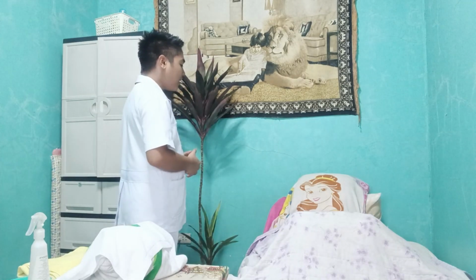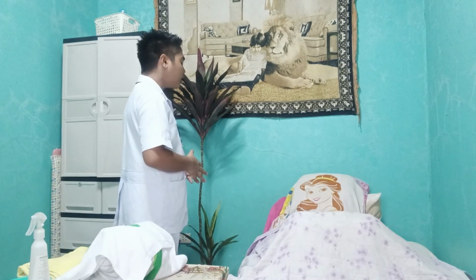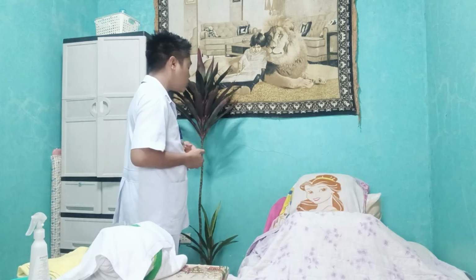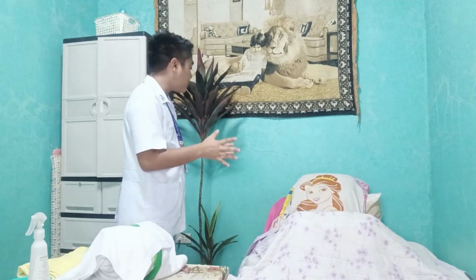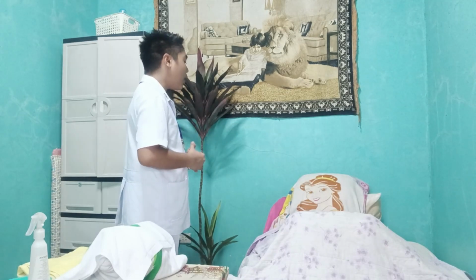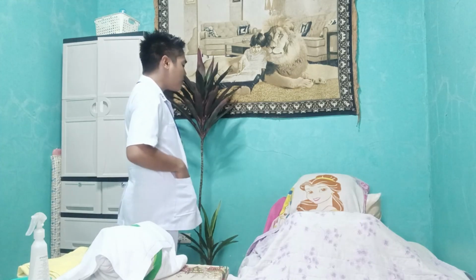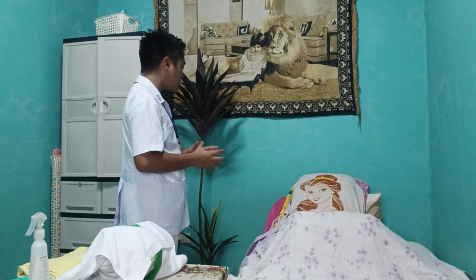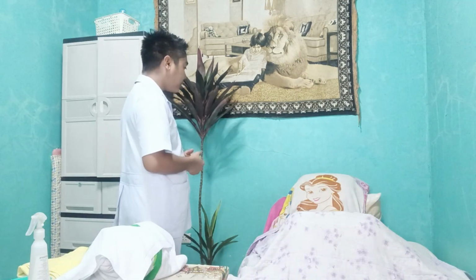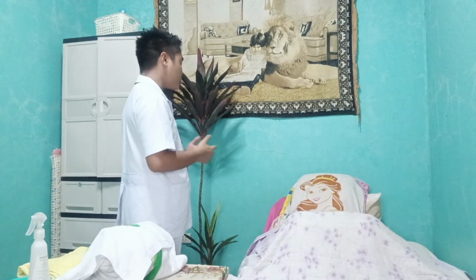All right, Lilibeth, we understand that you are having difficulty urinating, and so your doctor, Dr. Santos, has ordered for you to have a urinary catheter. So what I am going to do is to insert a tube through your urethra and connect it to your bladder so that you can excrete your urine. Okay? So later, during the procedure, I am going to expose your genital area. And you might feel a little uncomfortable during the procedure, but afterwards, you should feel relief. Will that be all right? Do you have any clarifications or questions?